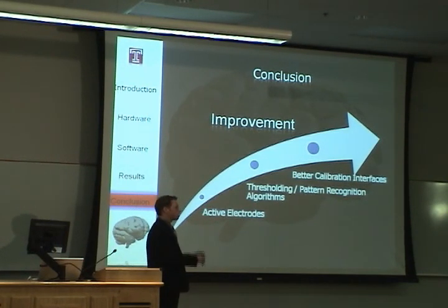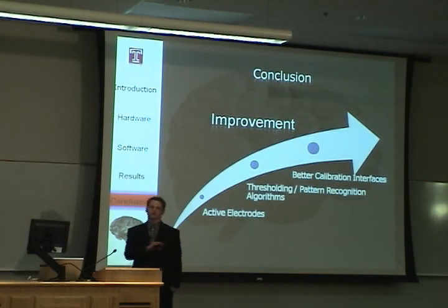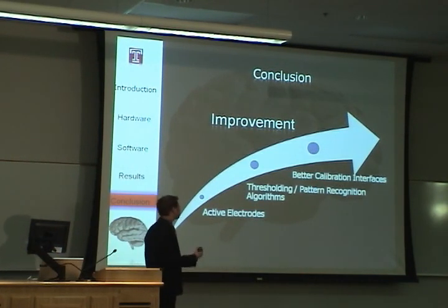We showed one where we had the squares, where a user was trying to move a cursor to desired blocks placed around the frame of a computer screen. Based on how fast they were moving, or how close they were getting to the target area, we controlled the beta and mu values on their weights. Like I said, we weren't able to graph it onto our implementation of the processing, but that's one thing that can be improved.